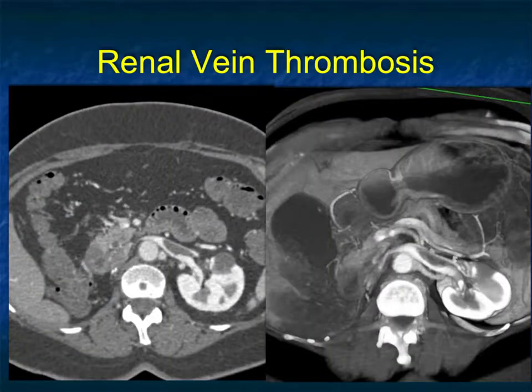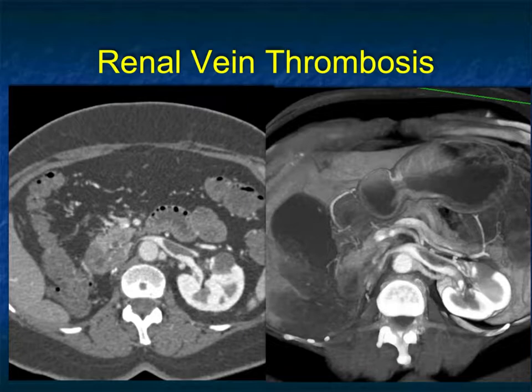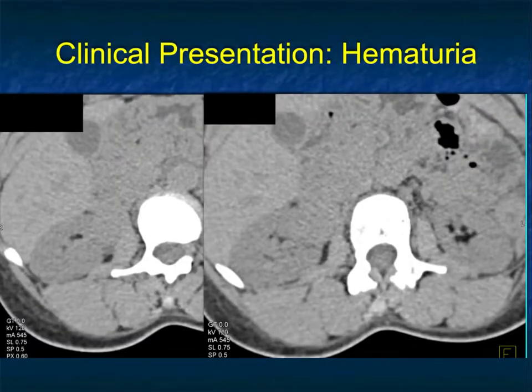Another case of non-occlusive renal vein thrombosis — this patient had a prior right nephrectomy. We tried to figure out why this patient had renal vein thrombosis; this was not tumor. The patient was treated with anticoagulant therapy and the renal vein thrombosis resolved. We think it was related to the patient's surgery and the right nephrectomy.